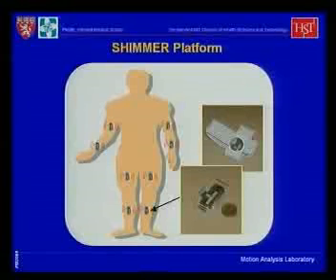They run essentially on Zigbee. They use the MSP430. They do have a 3-axis accelerometer, which is a Freescale on the motherboard, and then you have an attachment for a daughter board that can be either gyros or an EMG board or EKG board. So the board basically interfaces with a variety of different sensing technology.